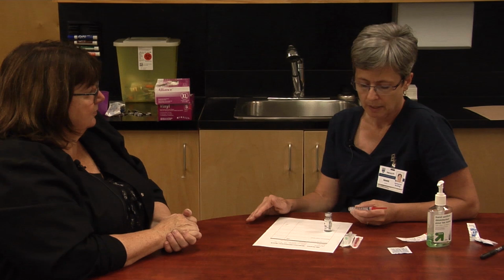Okay. So for medications, then we're probably looking at 1 ml syringes or 3 ml syringes. Exactly. Because if you think about any of the injections you're ever going to give, intramuscular injections, you can inject up to 3 mls into a site, although there's some variability in the literature. Subcutaneous injections can be up to 2 mls, but again, there's some variability. That would be a red flag for me if I was going to put in 5 mls of something. I'd say, did I do my math right?